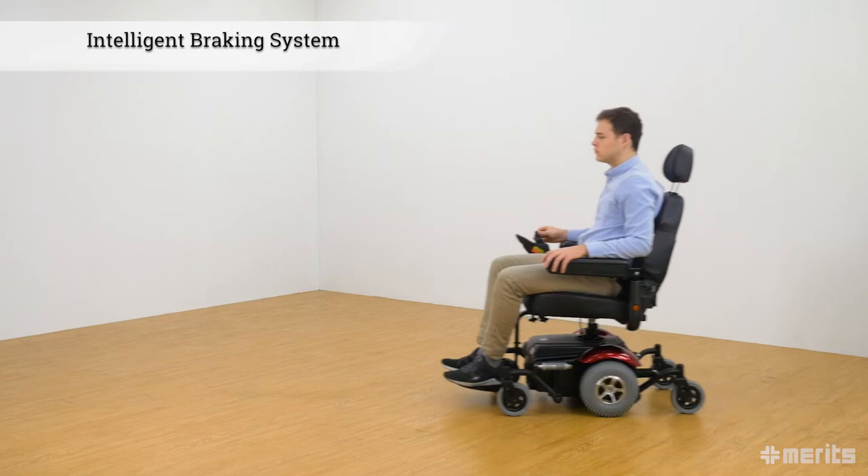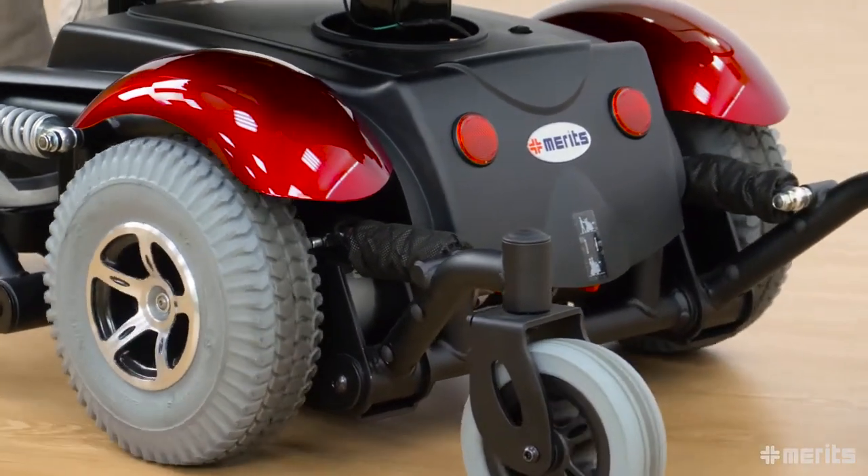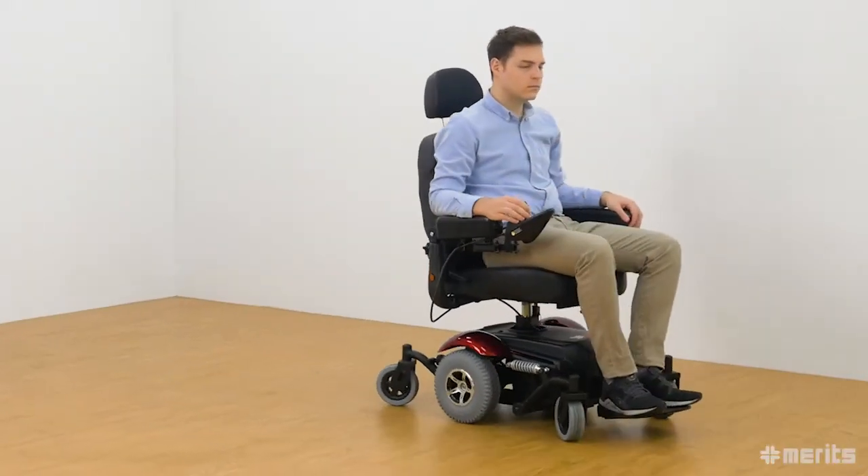The system is also regenerative in that it captures the kinetic energy produced by braking and transfers it to the batteries, thereby extending the range of the power chair.